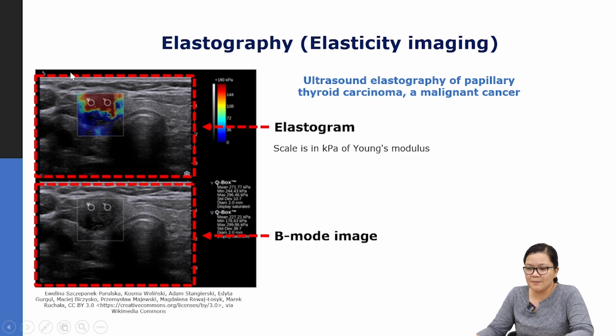So just giving you an example of what an elastography or an elastogram looks like. Here we plot the B-mode image down here. And there are some carcinoma regions around this location. But you can see that sometimes in B-mode images, tissues appear isoechoic, or these tumors appear isoechoic relative to the background surrounding tissues here.